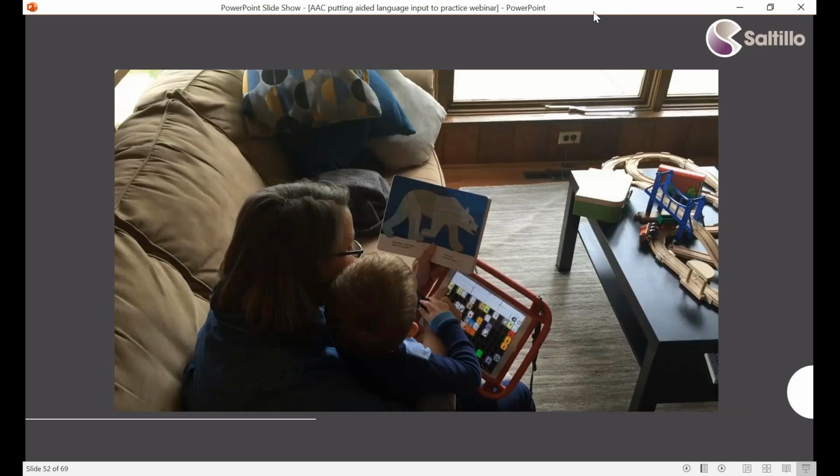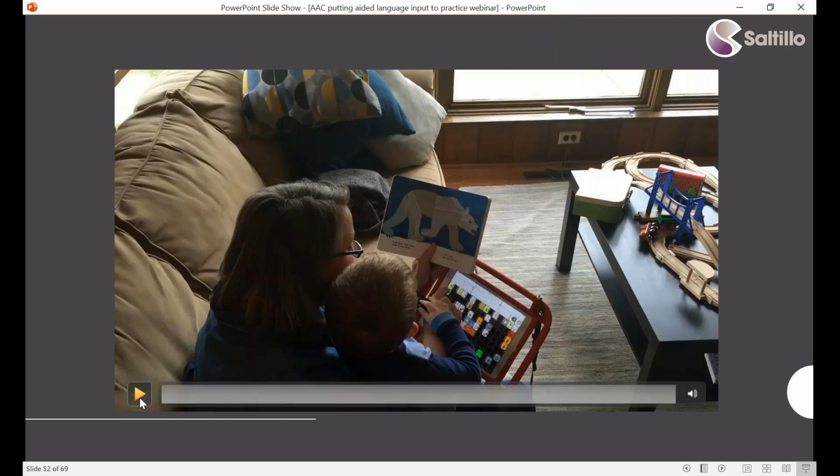Okay, so in a video example to put this all together, we're going to see our communication partner doing this exact thing. She's in a shared reading activity. She's going to be using the device and modeling. I want you to note whether you see any other communication partner strategies that we've talked about earlier in addition to modeling. If you see them, go ahead and type them in the chat window. We'll go ahead and play this out and see how it goes.